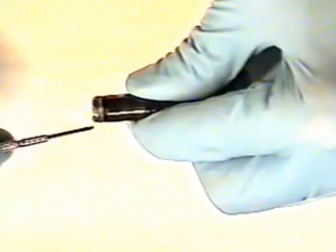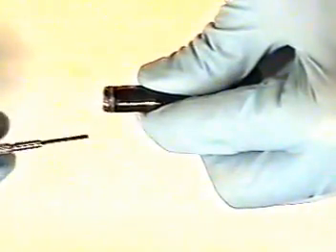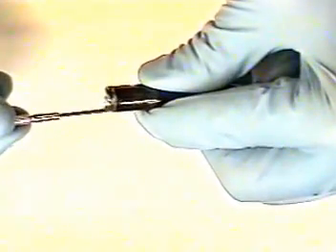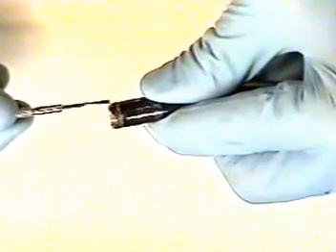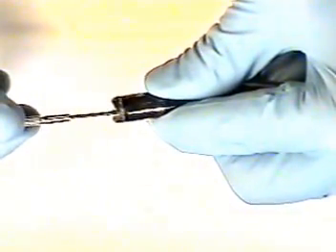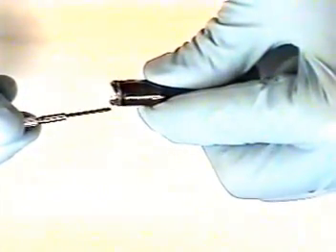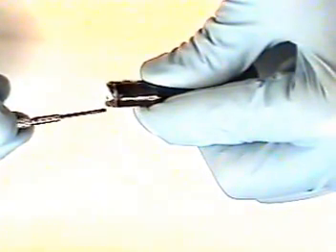When we are applying the last Scotch tape loop over the distal end, be sure to cover any holes. These are holes that access the air-water nozzle and image guide lens system. If these are glued over, it will cause difficulties when removing the air-water nozzle to clean or replace.